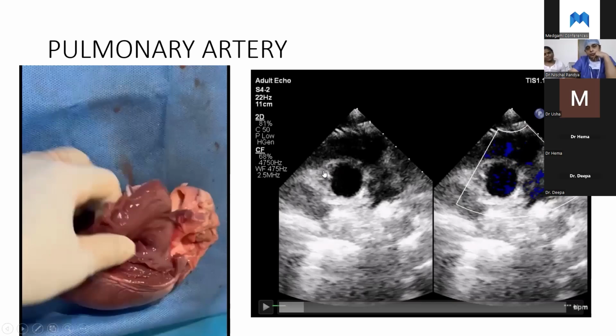Sometimes you've had to go in from the aorta, if that cusp is actually elongated, go in from the aorta and take a few bites supravalvar and fix it over there. So that would resuspend the cusp into the aorta, would shorten the leaflet as well. And if it's severely regurgitating, then we'd probably put some commissural sutures as well and make the cuspal height a little shorter. Okay.